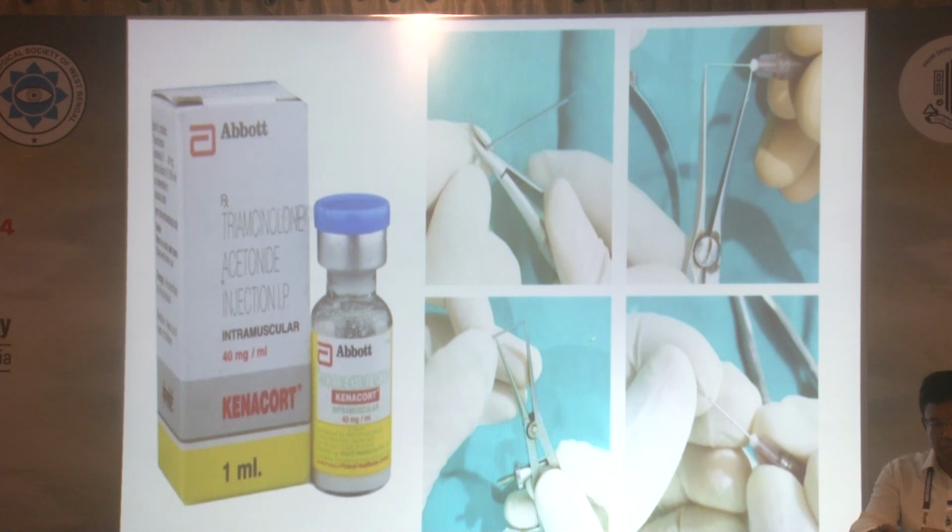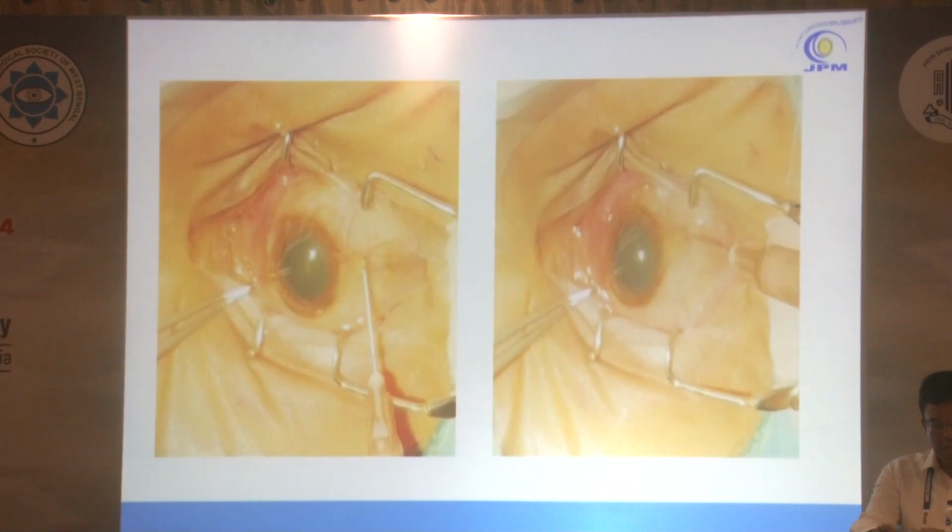So the measurements were taken exactly, excluding the needle tip and preparing a guard, thereby preparing a suprachoroidal needle which will reach the suprachoroidal space, which is assumed between 900 to 1000 microns.